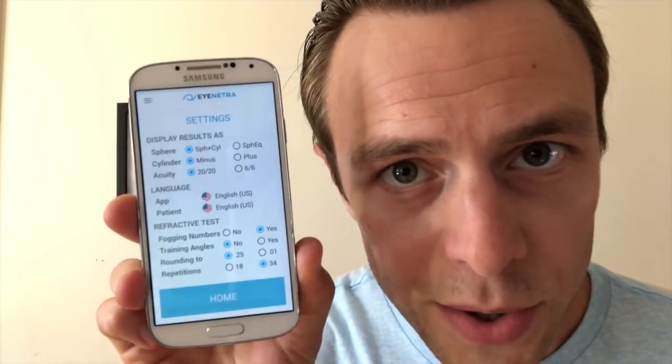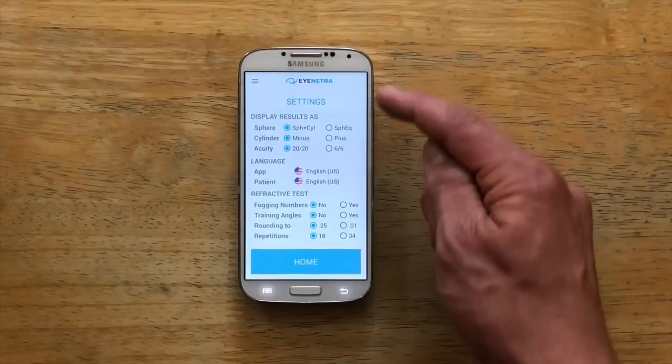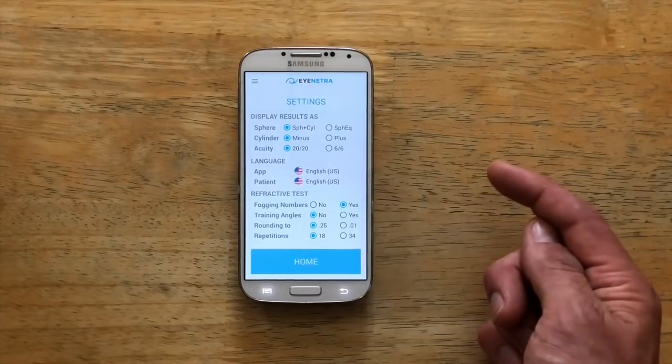On the bottom third we can make some changes to the refractive test itself. Fogging numbers: this feature turns on an additional fogging procedure to mitigate patient accommodation. By selecting yes, the patient will see a randomly generated blue number receding into the background following each click, meant to relax the patient's eyes between clicks. If you're seeing patients with strong accommodation issues — like kids or teenagers — you can turn on this feature to mitigate its effect on the results.